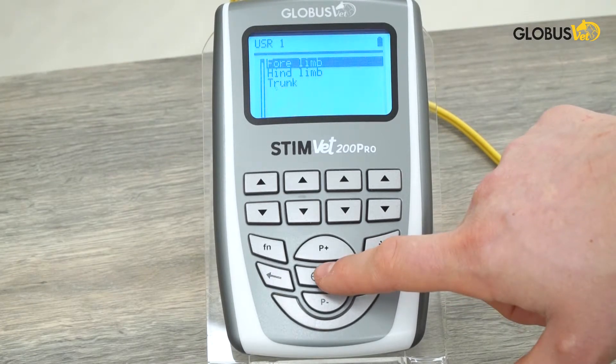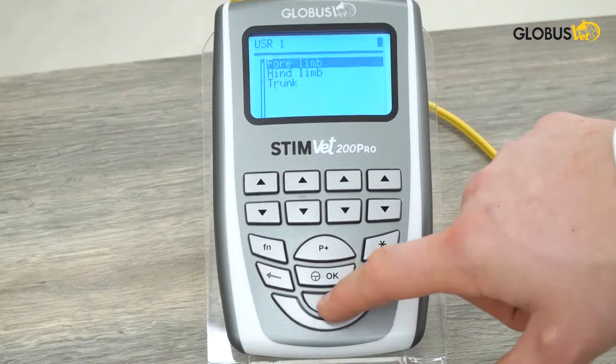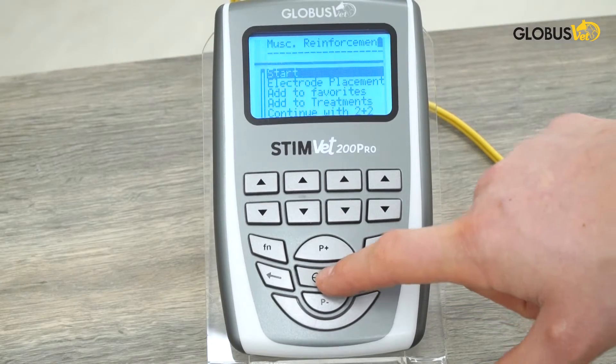We have forelimb, hindlimb, and trunk. We'll go over to the hindlimb and then we can hit the start button.